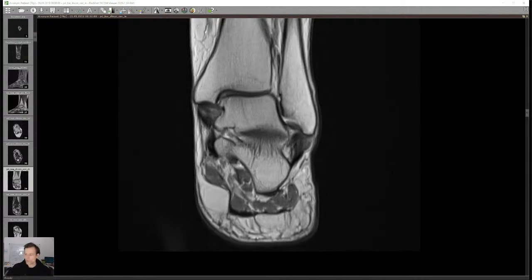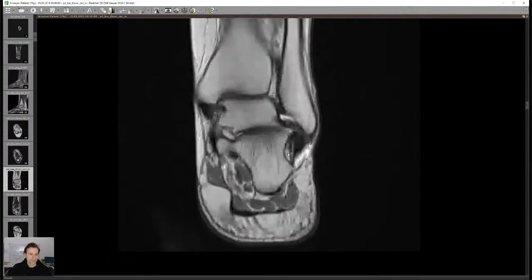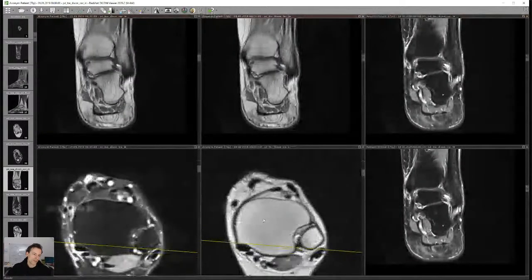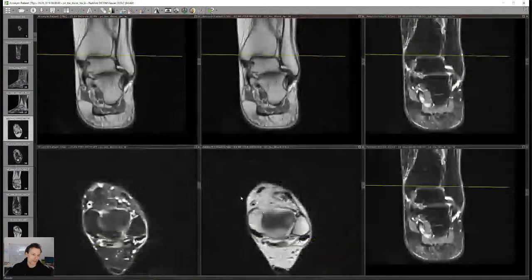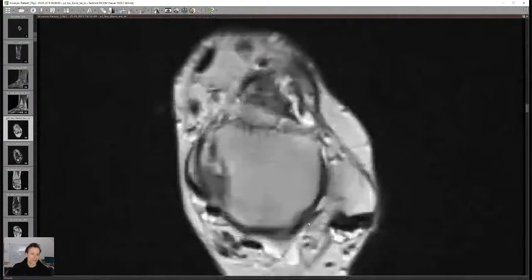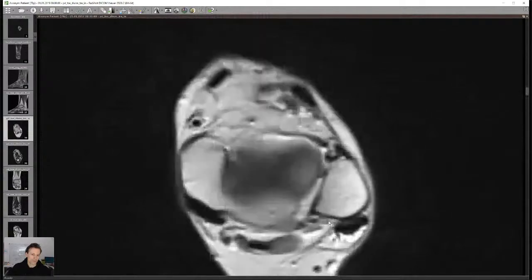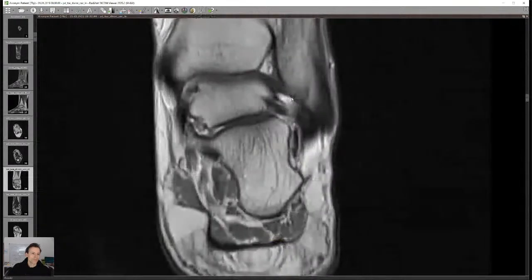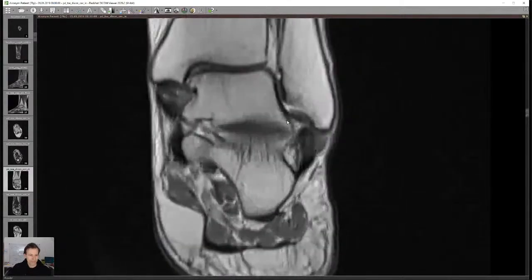The last lateral ligament is the posterior talofibular ligament (PTFL) — this ligament on the back here. It is hardly ever torn, so don't spend too much time worrying about it. It's often a little wavy in appearance. This ligament is practically always intact.